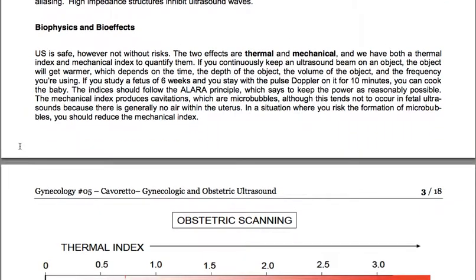Biophysics and bioeffects. Ultrasound is safe, however not without risks. The two effects are thermal and mechanical, and you have both a thermal index and a mechanical index to quantify them. If you continuously keep an ultrasound beam on an object, the object will get warmer, which depends on the time, the depth of the object, the volume of the object, and the frequency you are using. If you study a fetus of 6 weeks and you stay with the pulse Doppler on it for 10 minutes, you can cook the baby.